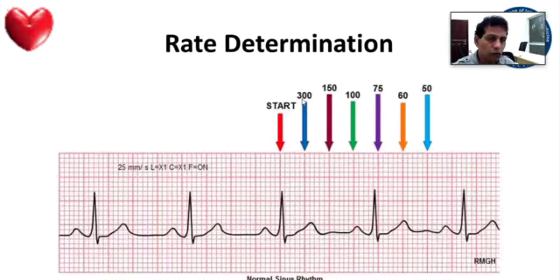So if you know this, in many ECGs you can roughly calculate the heart rate. So at least I can tell you that this is a little less than 4, but more than 3. It is between 75 and close to 100. So I would say this is about 80. Heart rate of about 80.